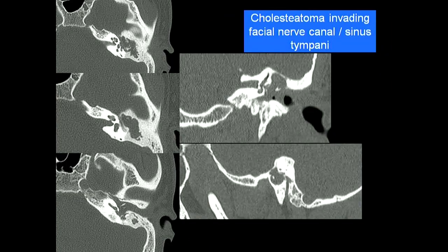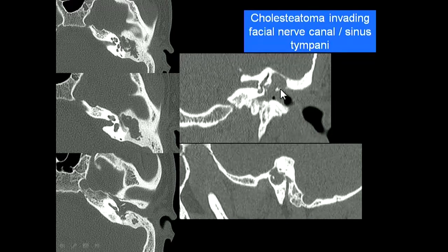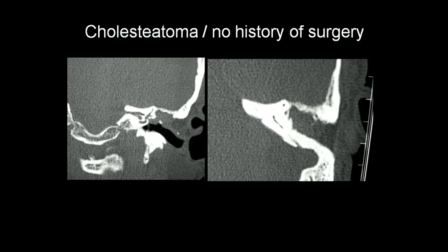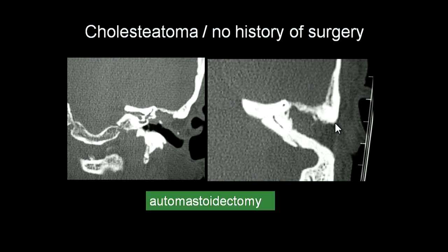This patient has extensive erosions involving the facial nerve canal near its first part, and the horizontal facial nerve canal area is also involved. The horizontal semicircular canal is also eroded, and there is expansion in the region of the posterior facial nerve. This patient had no surgical history, but had a defect and a history of discharge — this is essentially an auto-mastoidectomy created by the cholesteatoma.